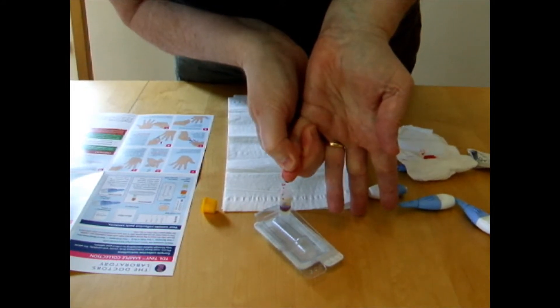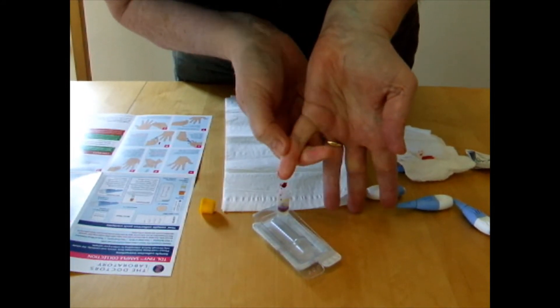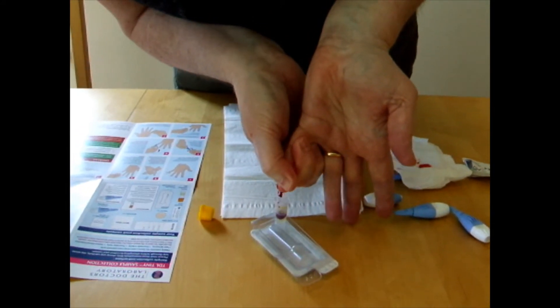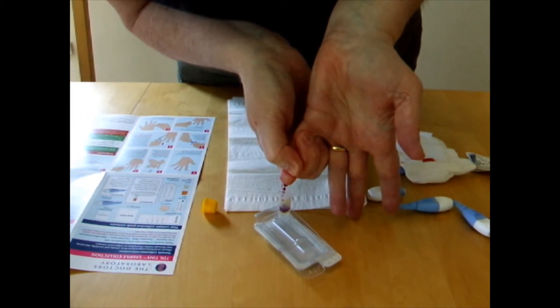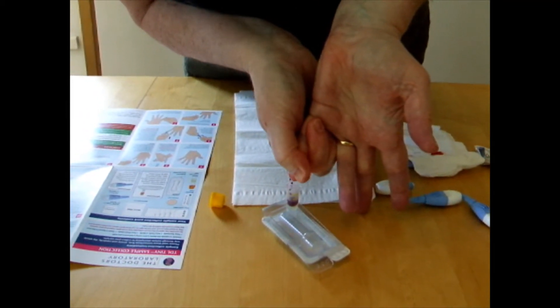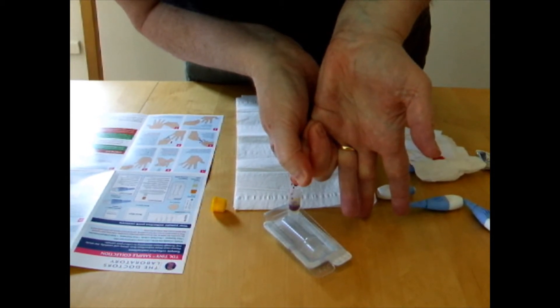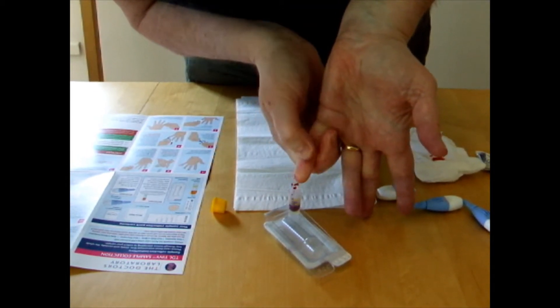And what you're trying to do is get enough blood in the tube to meet the top. There's two yellow lines you need to get it to the yellow line at the top.